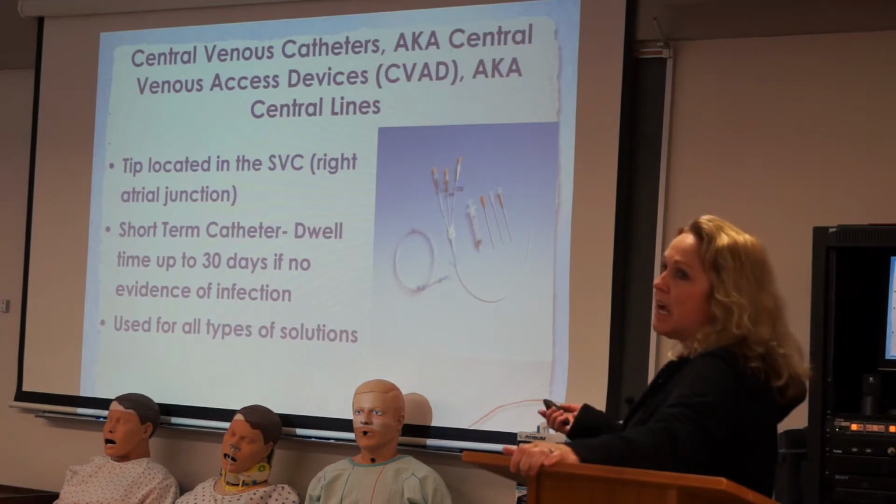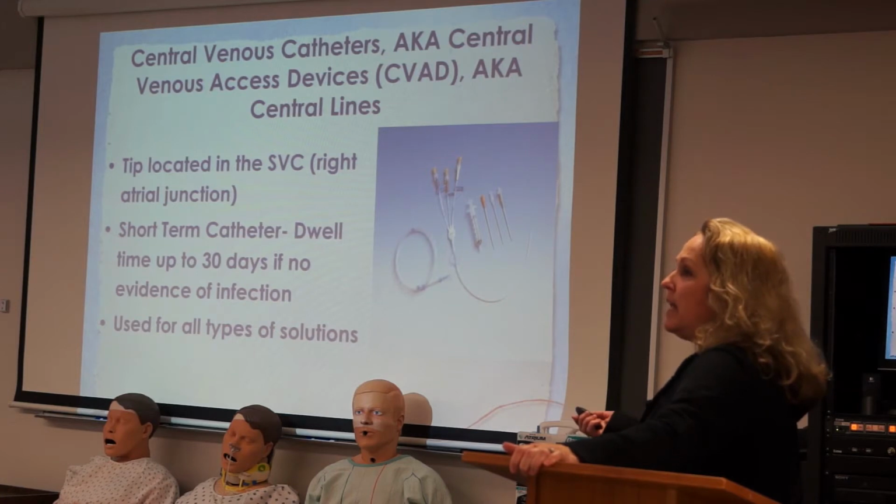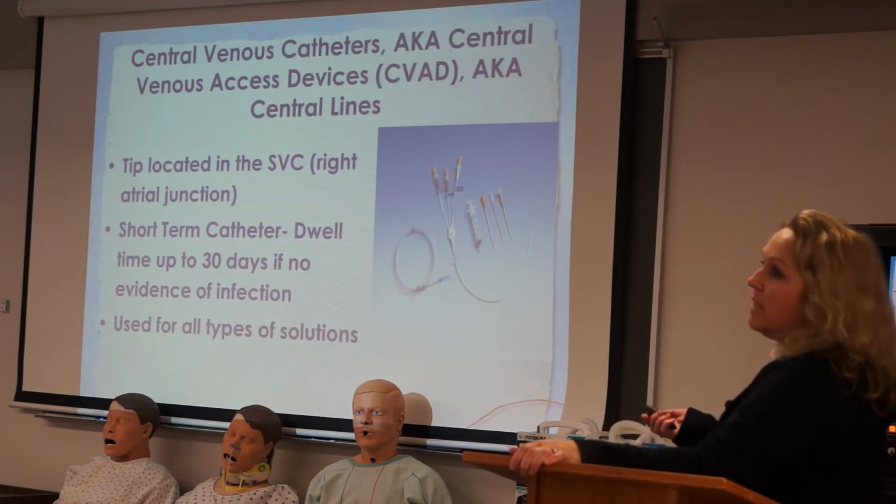Anything can go through these lines. You can put TPN, you can put chemotherapy, blood, anything can go through them, whereas a peripheral IV, you can't.